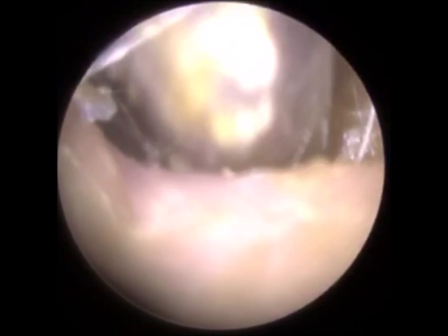See, the lens has gone slightly dark and misty. It's just because of that fluid. As well as the bleeding, when you do manage to elevate and retract some skin of the canal wall, it oozes that fluid, that moistness that's present, and it can smear the screen again. But as you can see, I can see everything I'm doing, it's not affecting my ability to perform the procedure at all.